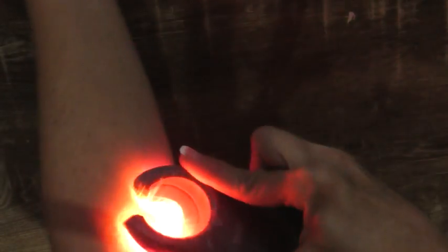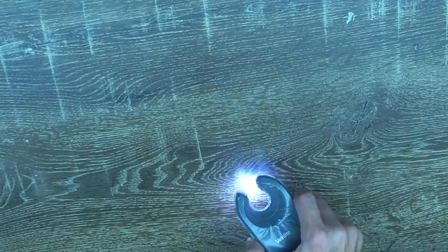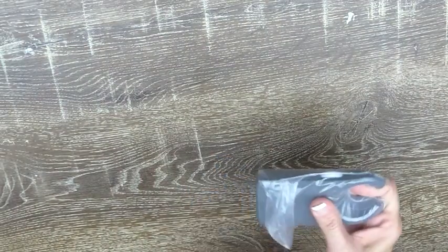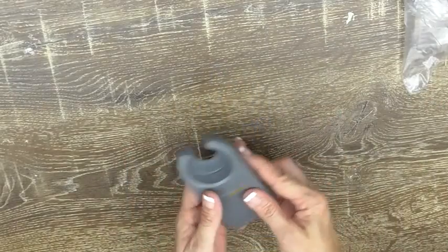I can't quite catch the vein on camera, but I can see it in real life and it works really well. I would totally recommend this — it's a nice little tool to have.